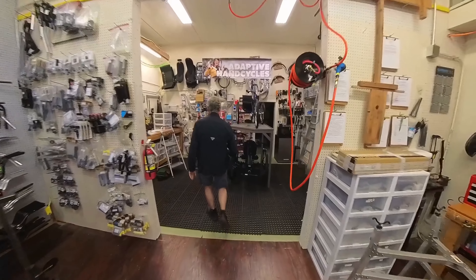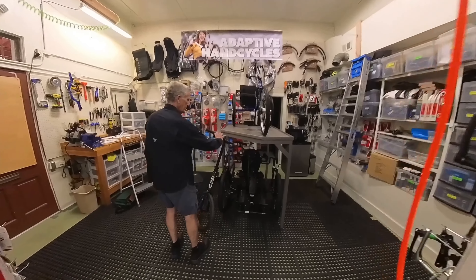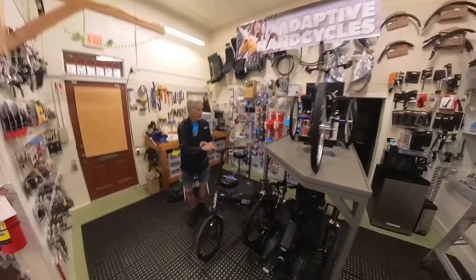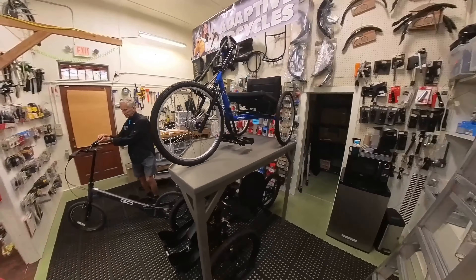This is our adaptive hand cycle section. These are all hand cycles.